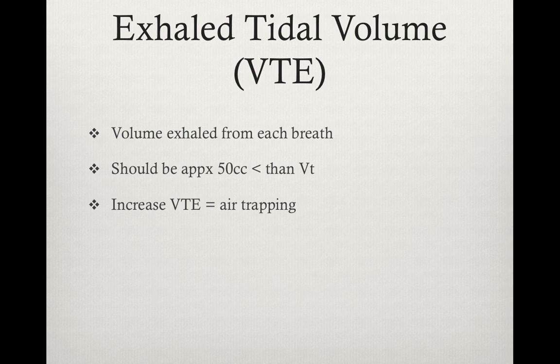Exhaled tidal volume, or VTE. Exhaled tidal volume can be measured on either volume-based ventilation or on pressure control ventilation. With pressure ventilation, it tells us how well that pressure controlled breath is actually working. So if I start with my pressure controlled breath at, say, 20/5, and on a standard adult we're only pulling a 300 cc tidal volume, well then I probably need to go up on my pressure a little bit to see if we can create more accurate tidal volumes.